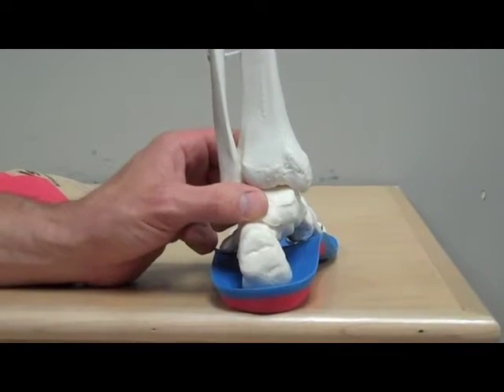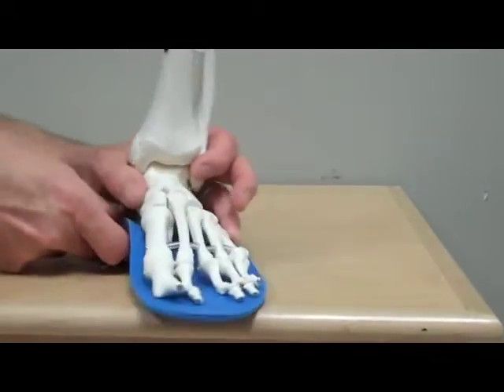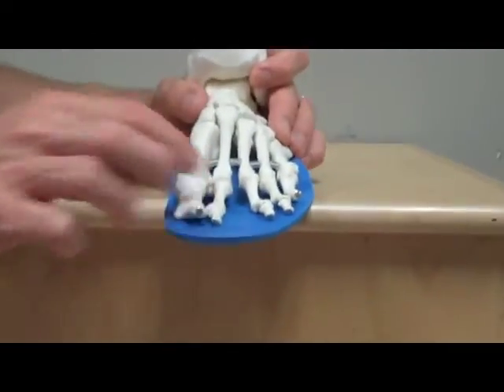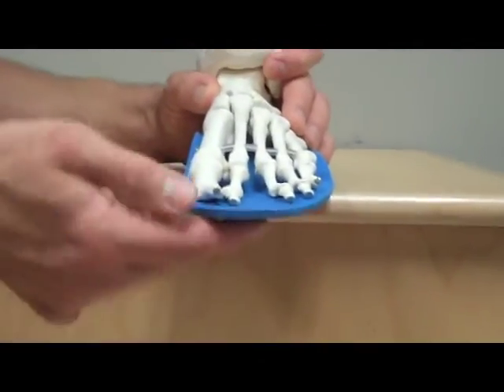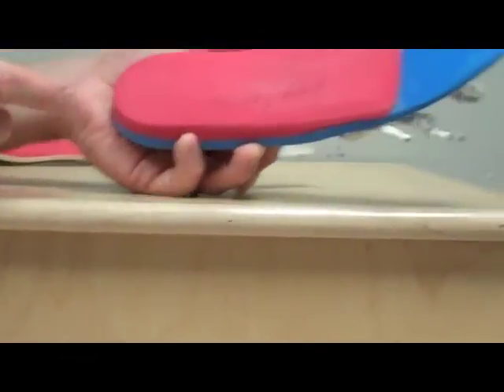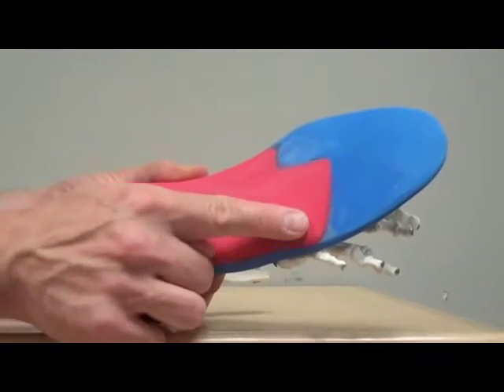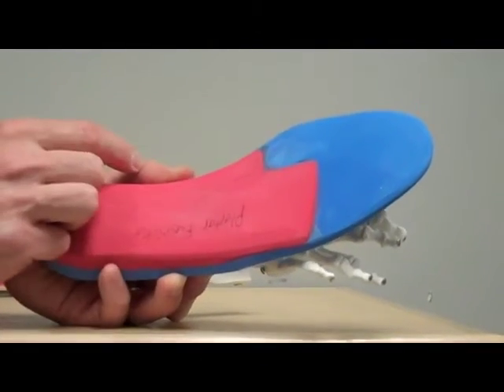for somebody who's overpronated, who's flat-footed. And then what we do in the front, this is going to be a little bit tougher to see, is that we keep this lower relative to this over here. I don't know if you can see that on the bottom here, but if I flip this over, you can see what I've done here. So I've kept it thick over here, and I've skived it and thinned it down through here.